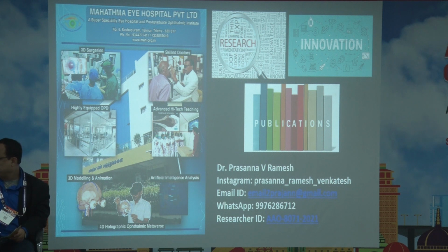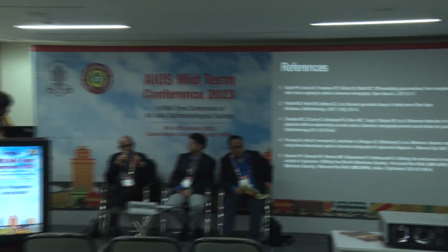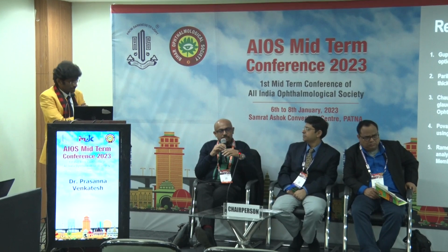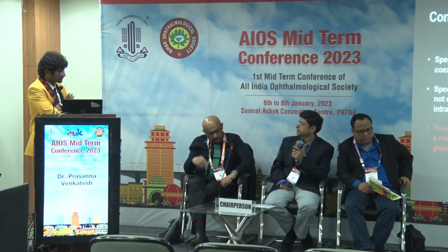I would also look at the visual fields and say that the eye which had a predominant temporal defect, if they start developing nasal defect, you know that probably there is an overlay of glaucoma on the previous neurological problem, and if that's progressing. So it was a more holistic, not only the OCT.